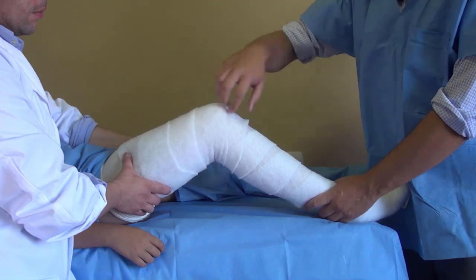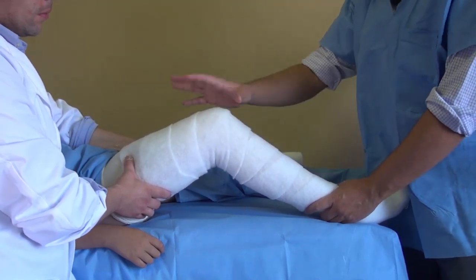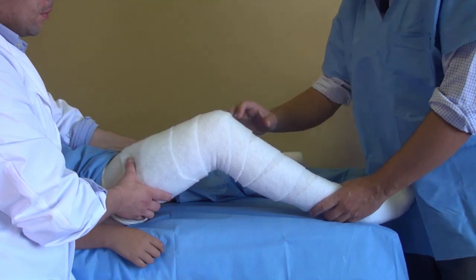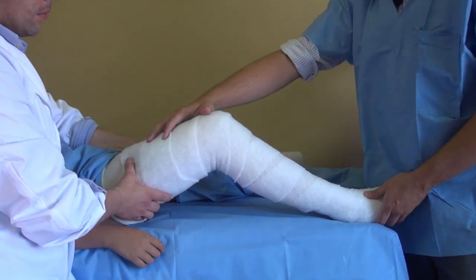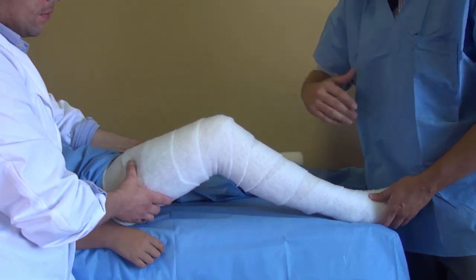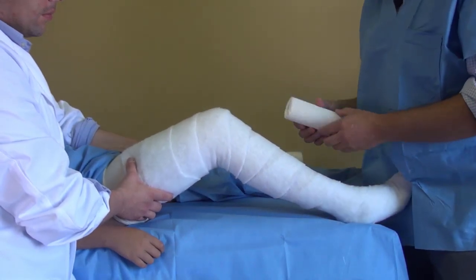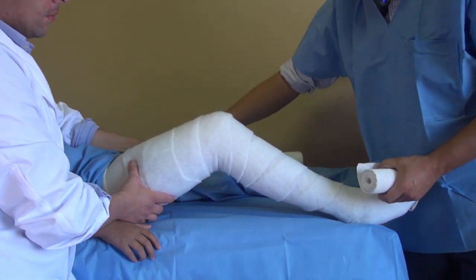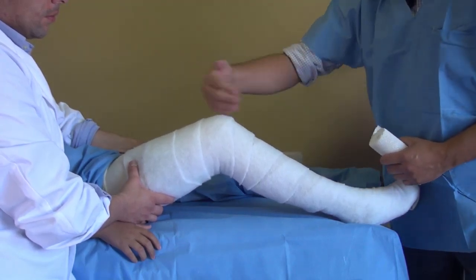We usually do a 30-degree flexion for a long leg cast. There are two most common ways to do it: first do a short leg and then unite it with the rest of the thigh, or just do it in one time, going all the way up and coming down. We're going to first do a short boot with a 15-centimeter cast and then use a 20-centimeter cast to go all the way up.